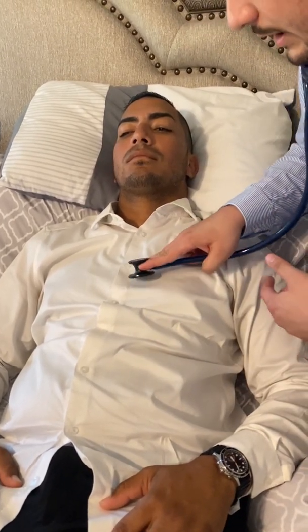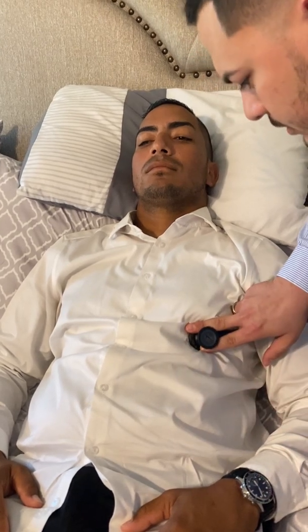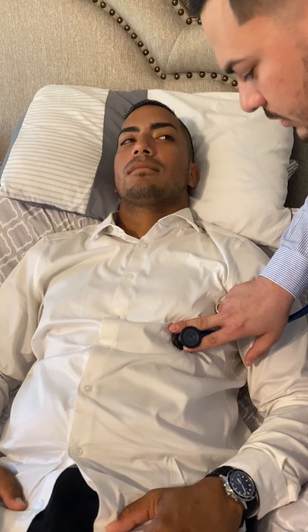Now I'm gonna place my diaphragm over the fourth intercostal space to listen to his tricuspid valve. Good. Now I'm gonna listen to his mitral valve, which is the fifth intercostal space, mid-clavicular line, which is also known as the apex of the heart.